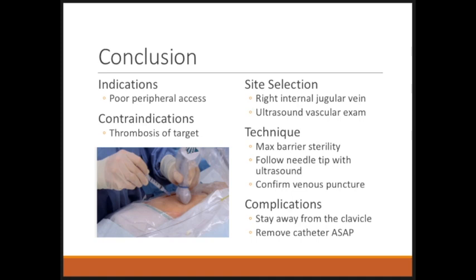Always maintain maximum sterile technique to prevent catheter-related bloodstream infections. Really practice following the needle tip with your ultrasound. That will really increase your accuracy and success, and decrease complications. And always confirm venous puncture and never dilate an artery.